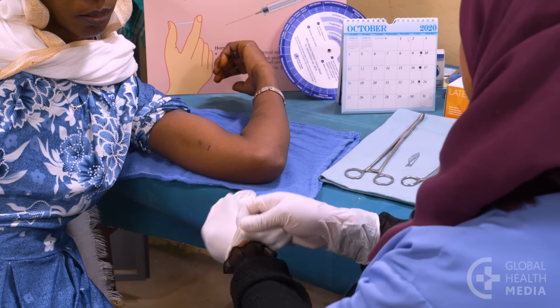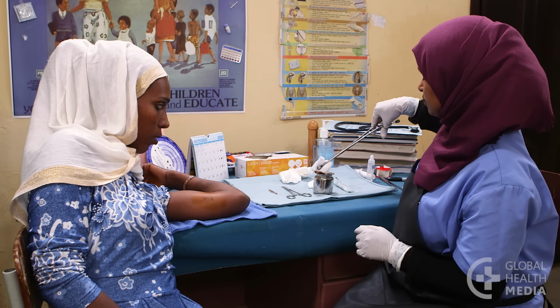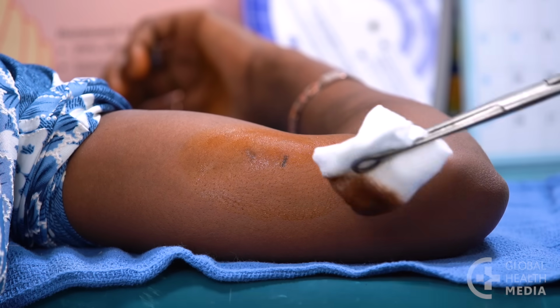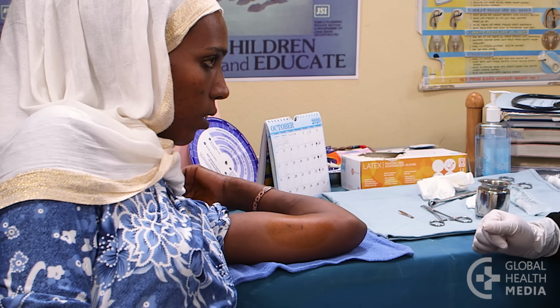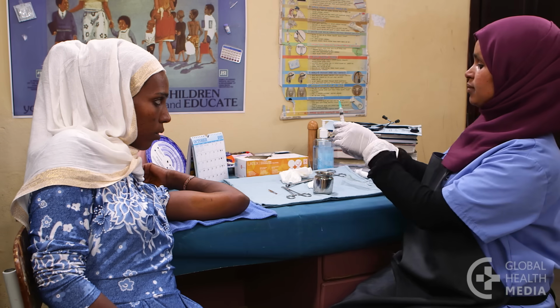Put on gloves. Then, clean the incision site with antiseptic. Apply it in a circular motion from the inside to the outside 2 times. Let the betadine dry completely. Then, draw up 1 milliliter of lidocaine.